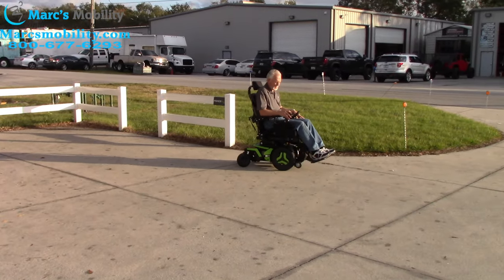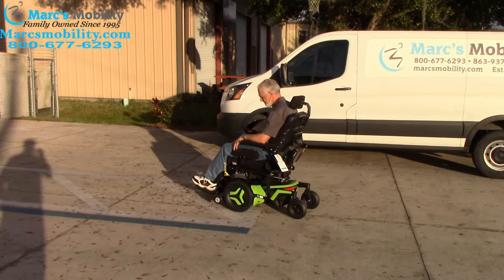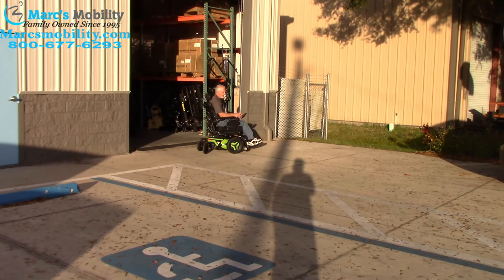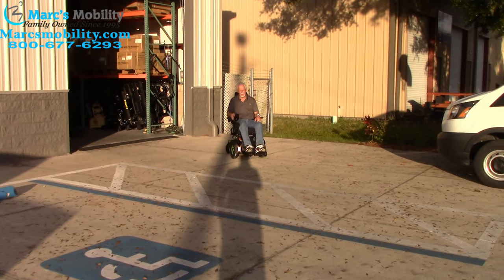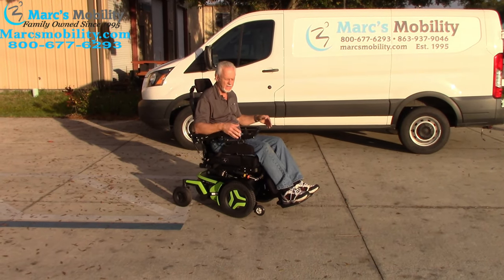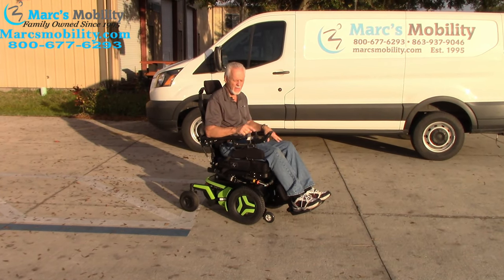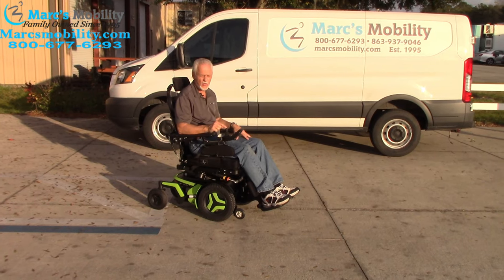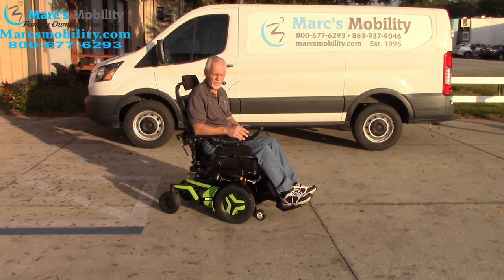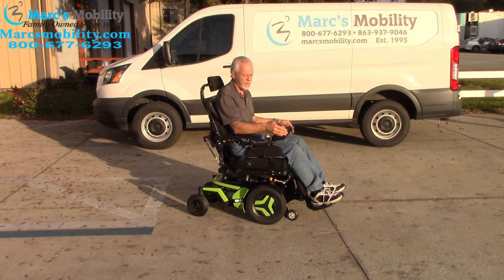This is the Permobil F3 — six miles an hour top speed. I think it goes a little faster than six miles an hour, but it says six miles an hour. As soon as you let go, it brakes automatically. It's got built-in brakes, and you can control the speed by reducing it through the joystick or not pushing the joystick as far forward. If I push the joystick just a little bit, I'm barely moving — so you can adjust the speed with your hands or through the function on the joystick.